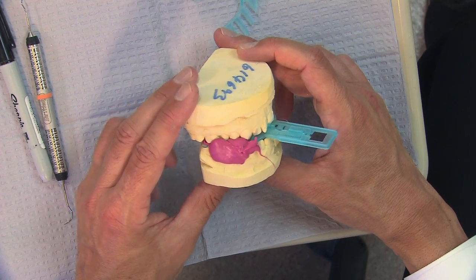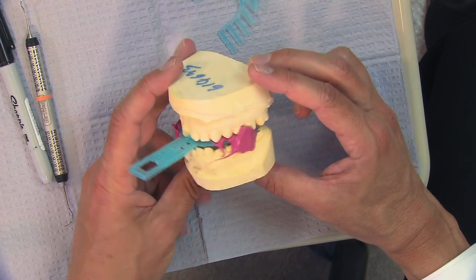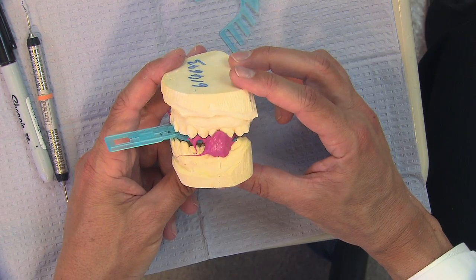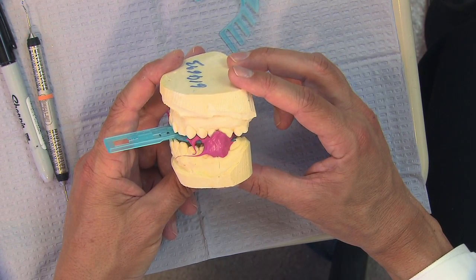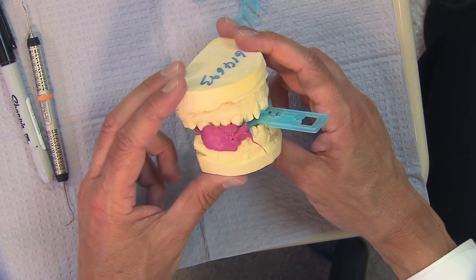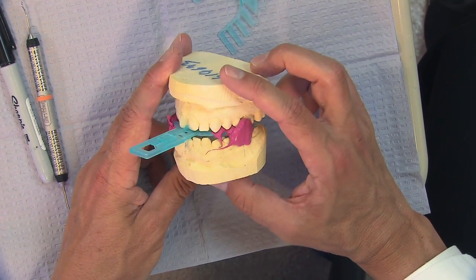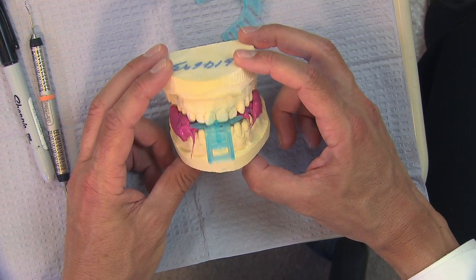And again, if the patient wears this for a period of time, say a week or so, and is still reporting snoring, then we're going to have them go to the next shortest length of the SL connectors and switch those up on the appliance. And again, that can be done at home. So let's go ahead and take a look now and follow this through on an actual patient.